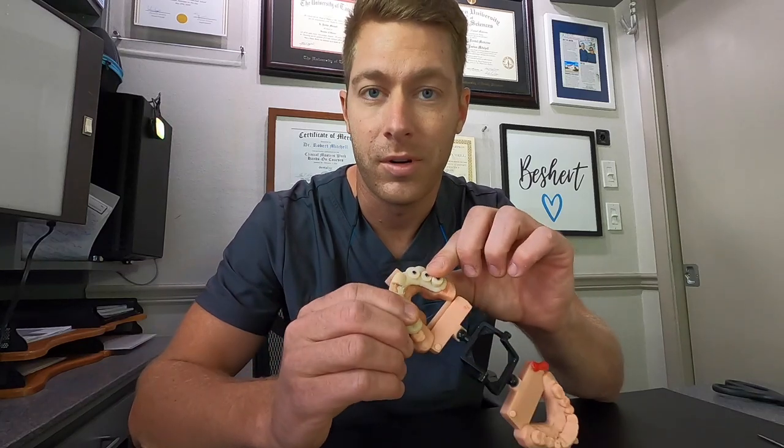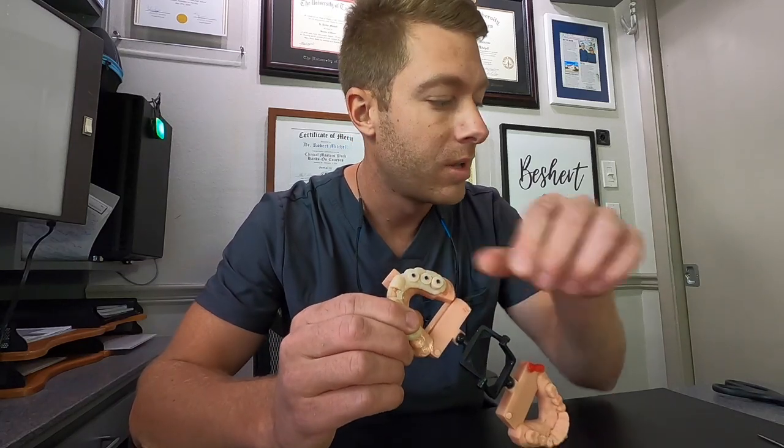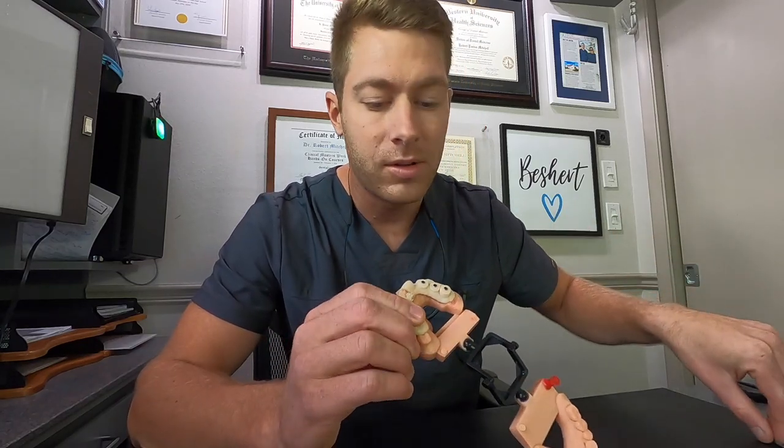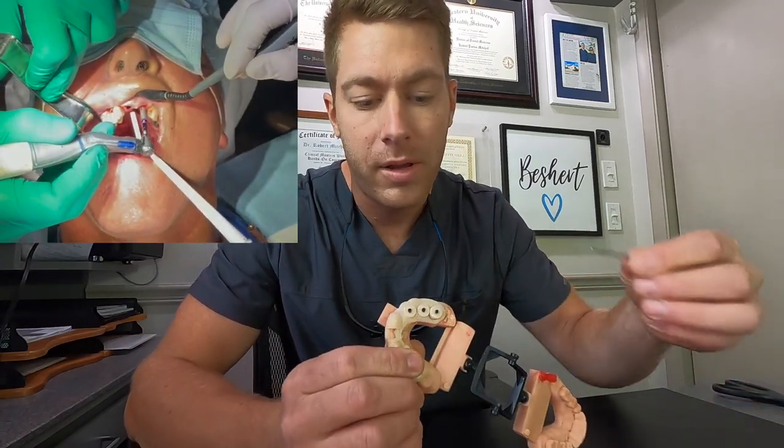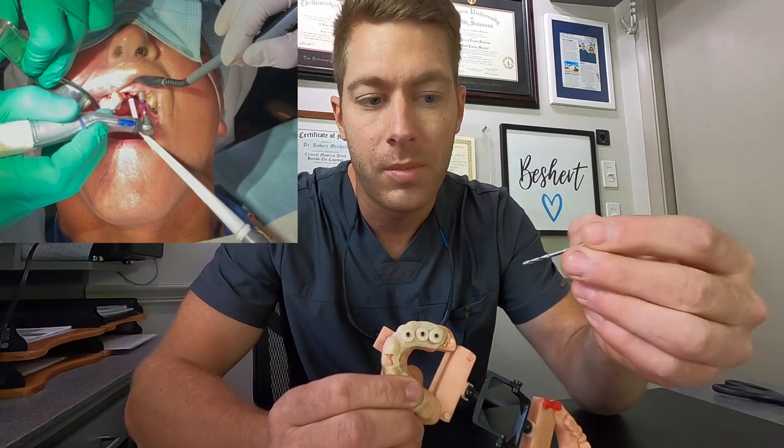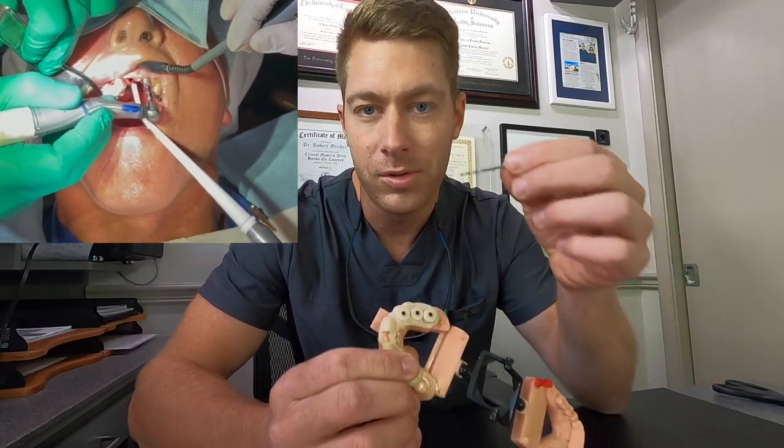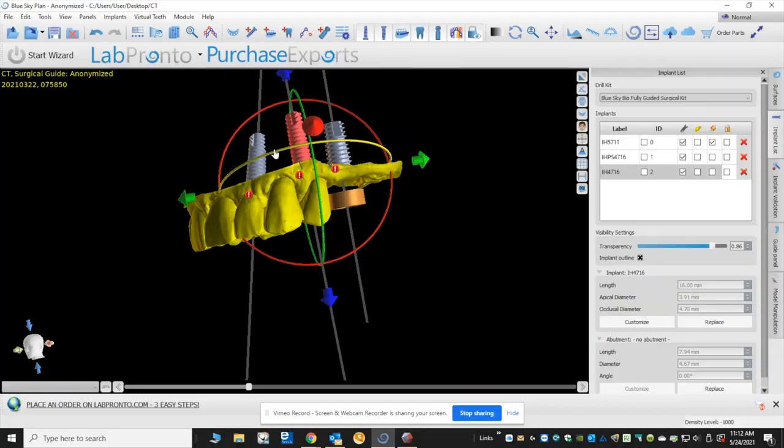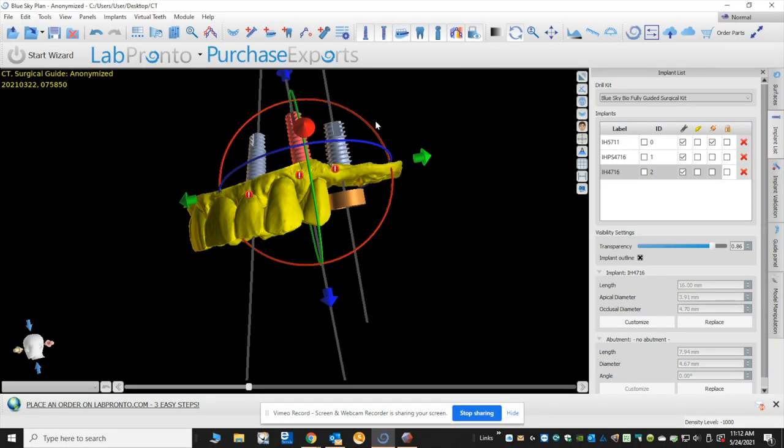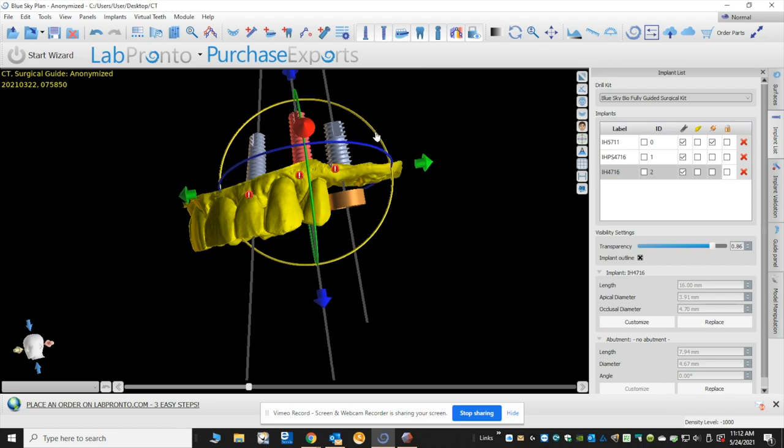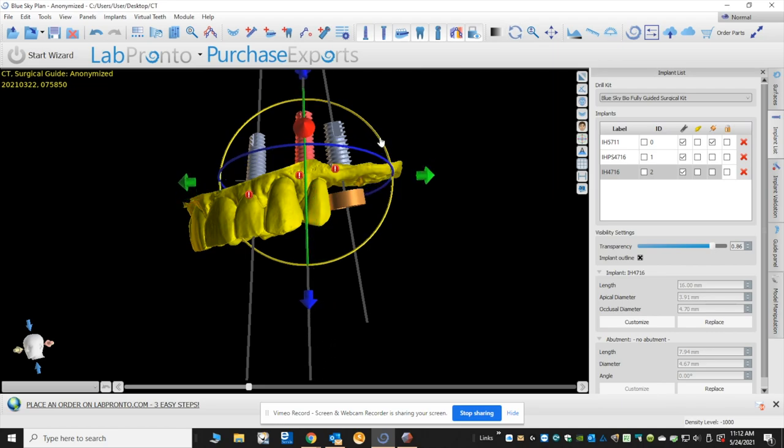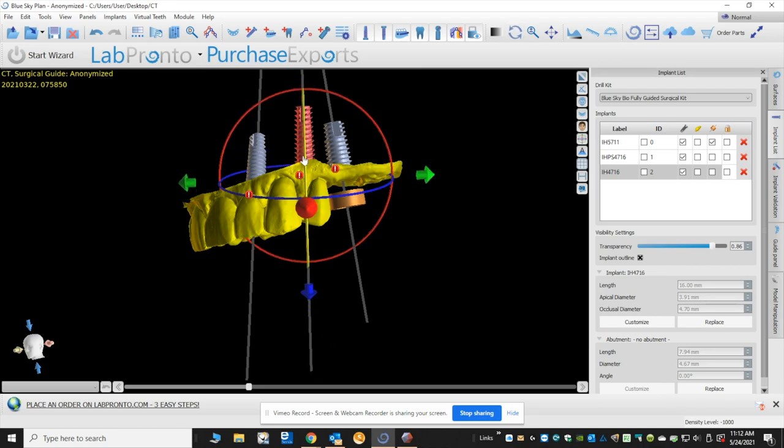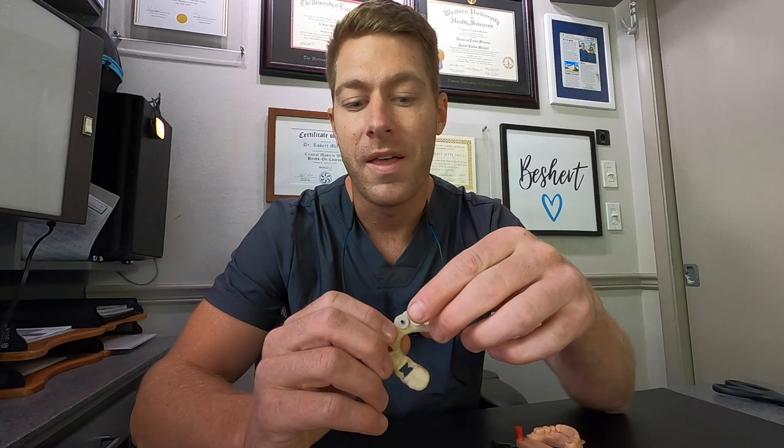This is an actual case that I've already used and these small pilot holes I'm able to use a pilot drill and go at the exact angle, direction, and depth to my pre-planned implants and that way it goes exactly as planned.